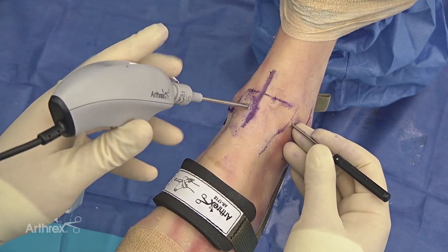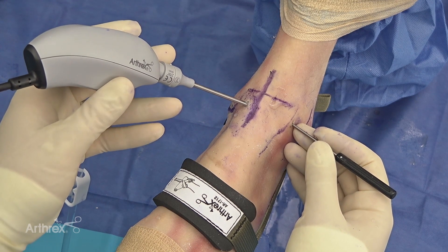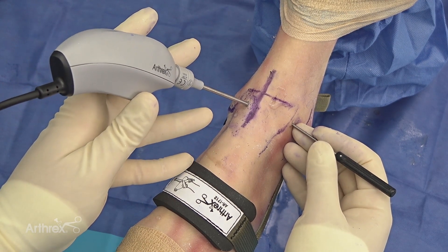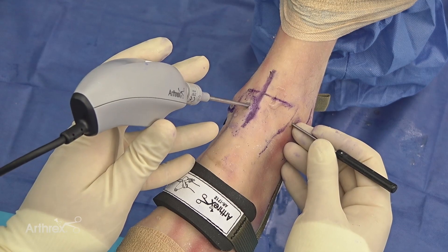Now let's discuss how to hold the instrument. I like to hold it in a few different ways depending on what you're using it for, but as you get comfortable using the nanoscope, I recommend initially resting your fifth finger on the ankle to avoid pistoning in and out of the ankle joint.